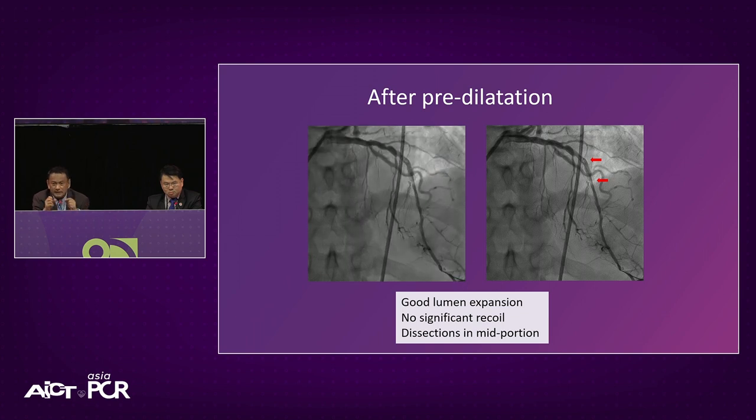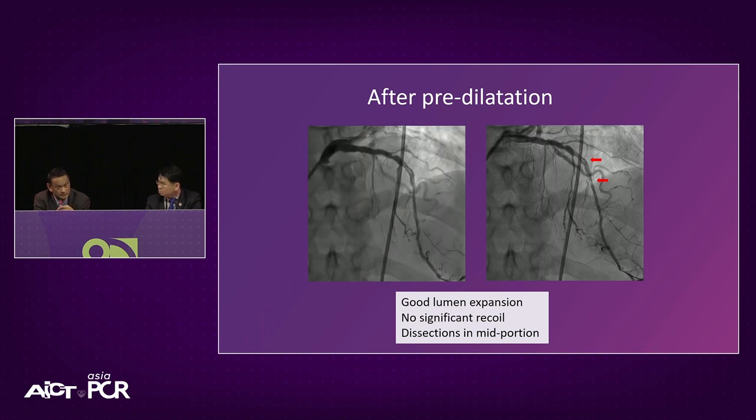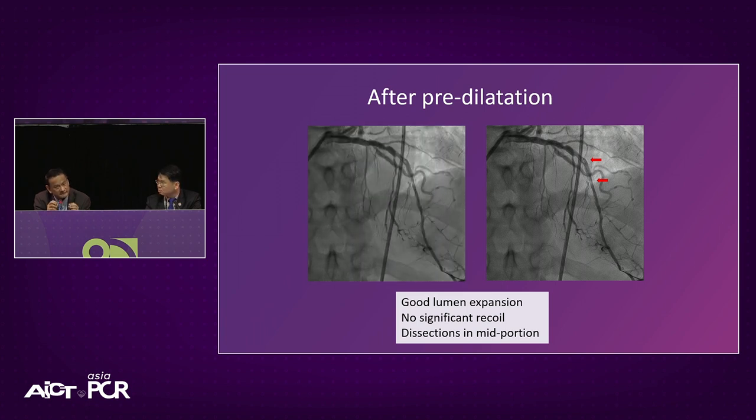Agree with Fahim? If you want to go for DCB, the most important thing is the flow and also the residual restenosis. If you have a residual stenosis of more than 30%, the chances of late restenosis are going to be much higher. As long as you can get a fairly acceptable residual stenosis, and the flow is good, you DCB it, because the vessel will heal and grow. And when you use paclitaxel, 70% of patients will have a vessel enlargement over time.